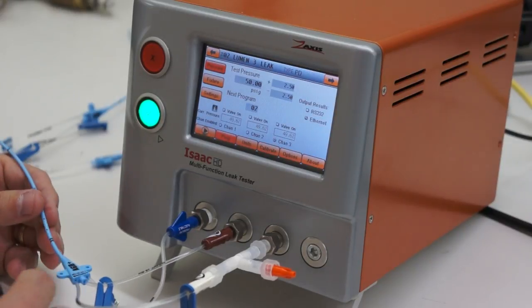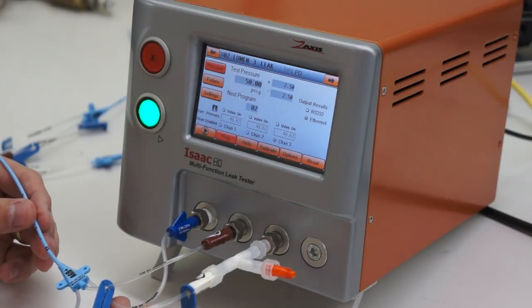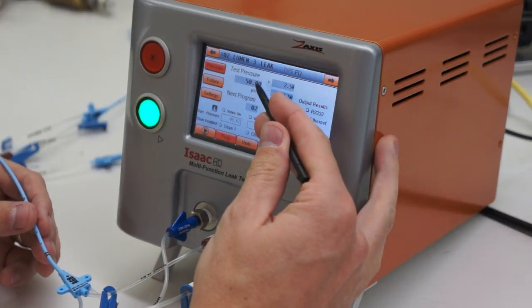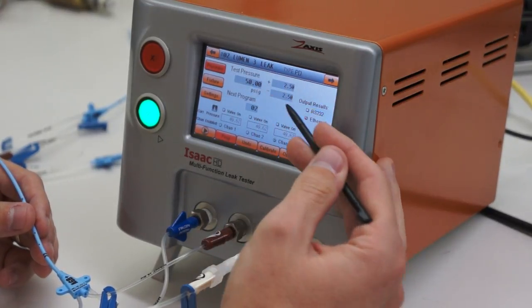We're doing a leak and flow test on a 3-lumen catheter. The leak test is done at 50 psi plus and minus 2.5 psi.